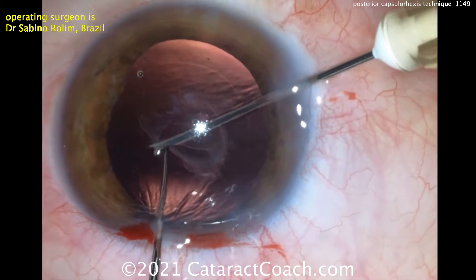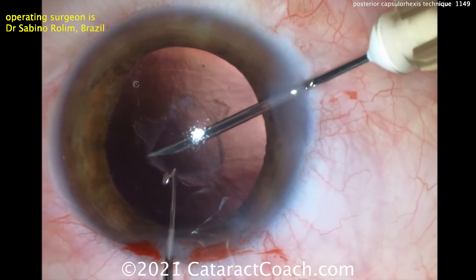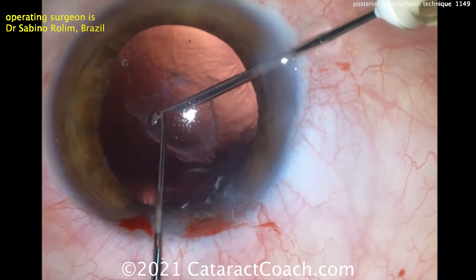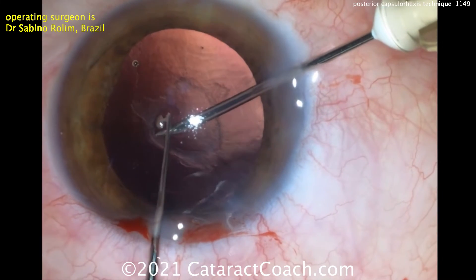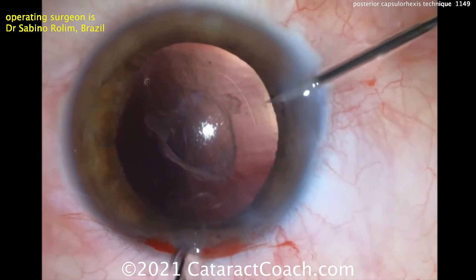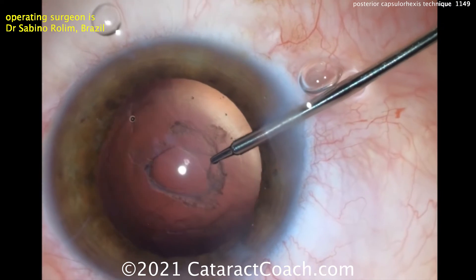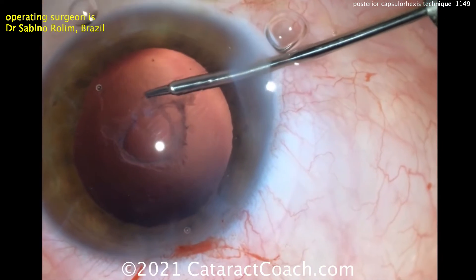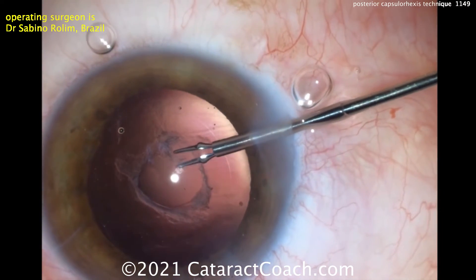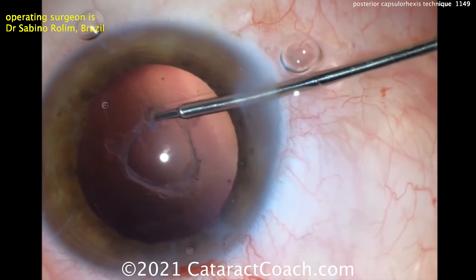Now you can go in again using the needle to try to cut around this area, and we do want to still make it continuous and curvilinear. You don't want a random jagged posterior capsule opening — you want a capsular rhexis of the posterior capsule. Notice the two-handed technique: the left hand provides traction, the right hand cuts the capsule. You can use micro forceps to grab that capsule, encompassing or encircling that posterior capsule opacity or plaque — that fibrotic area.